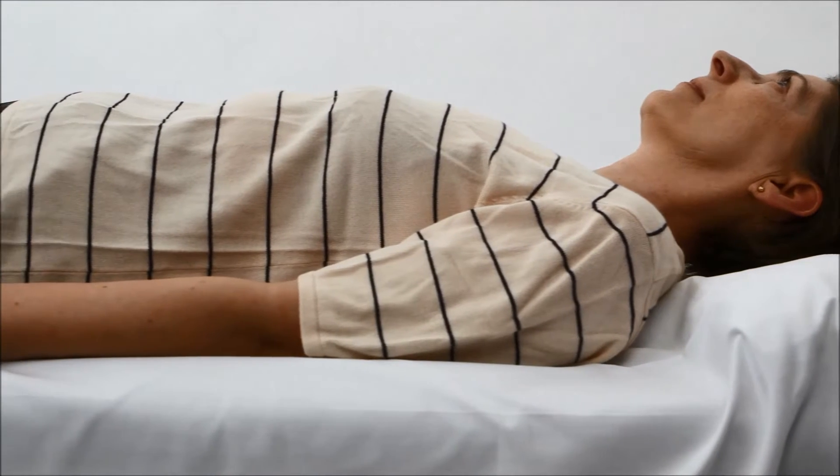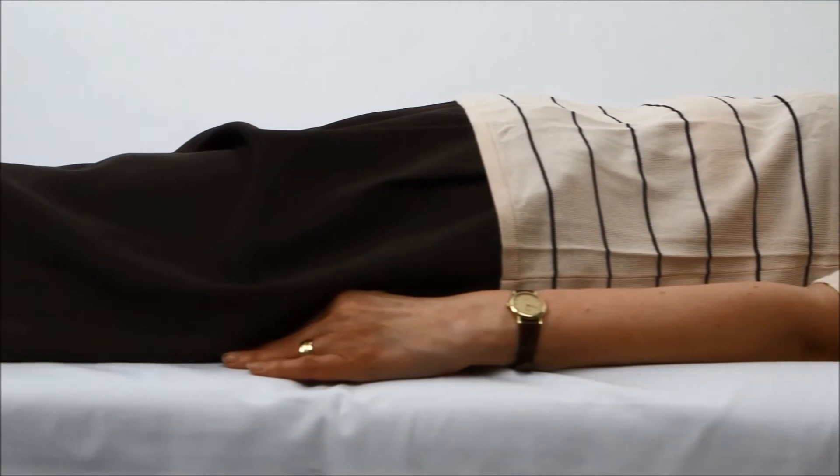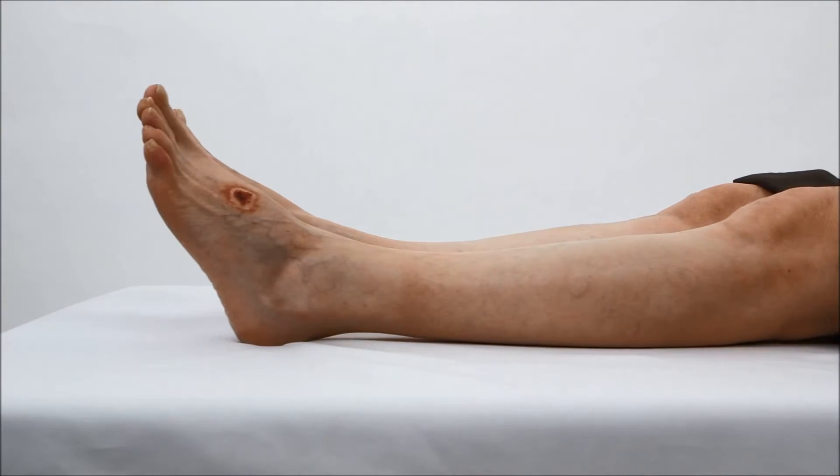For optimal results, TCP-02 measurements should be made with the patient at rest in a supine position. The patient should not speak during the examination. Keep the patient and extremity warm.